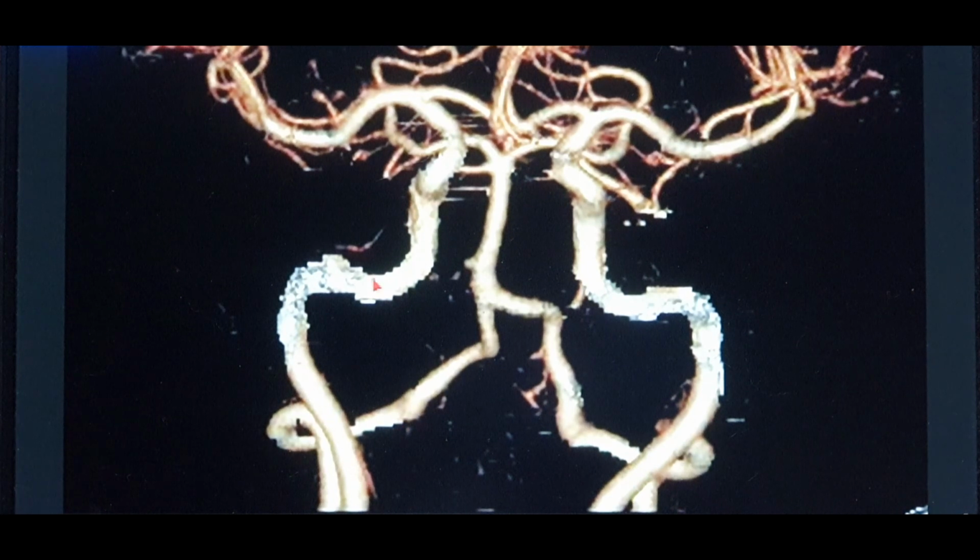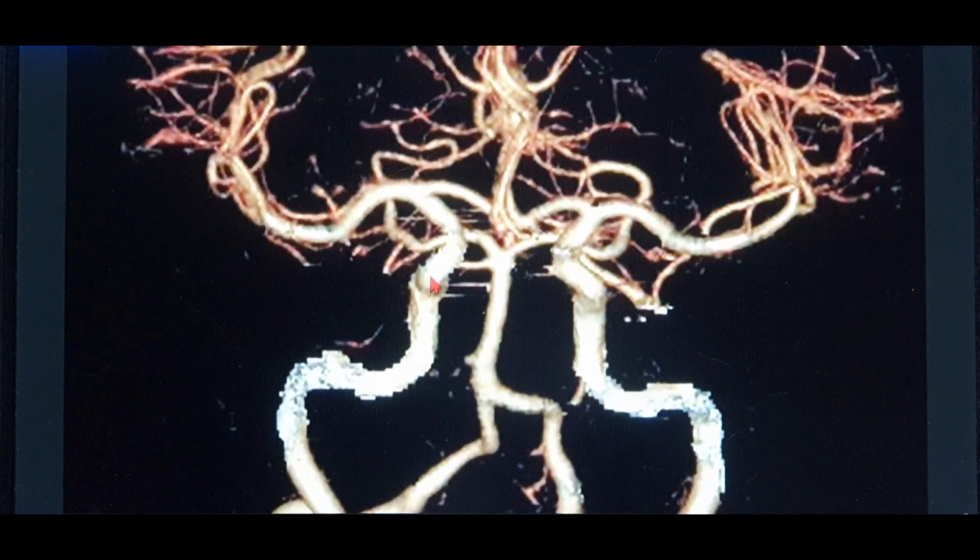Then it becomes the petrous part, then the foramen lacerum part, then the cavernous part. This is the cavernous part. And then this is the supraclinoid part, which terminates into the MCA, and this is the ACA, and that's the ACOM. So you can see this is the ACA, anterior cerebral, that's the middle cerebral, and that's the terminal part of the ICA, that's the C7.